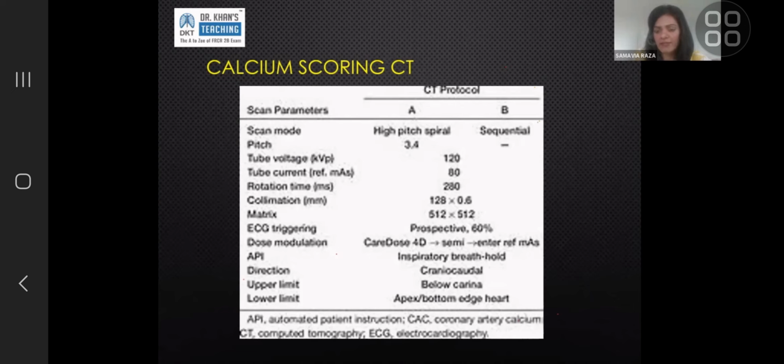So if you had a little bit of calcium or just under 400, 600 calcium, we think that we can have a reasonable CT image for you. Only then did they go ahead and do the angiogram. That is no longer the case. And the reason that used to be the case was only because of the machines that were available at that time. So the machines couldn't cope image quality wise to be able to see through the calcium, be able to reconstruct, have smart algorithms to reconstruct or cope with the calcium around the small caliber vessels. And the last few decades that has completely changed. The machines can definitely cope.